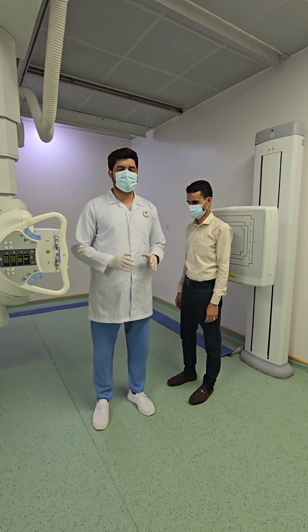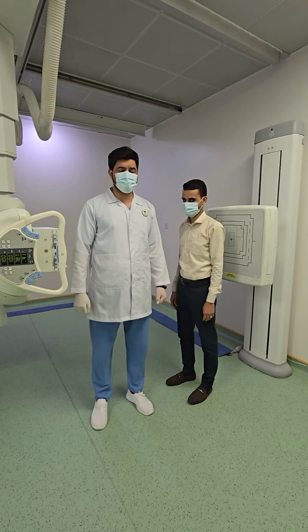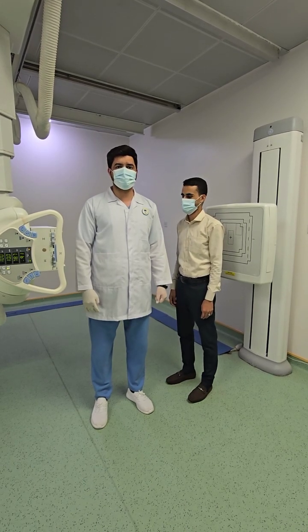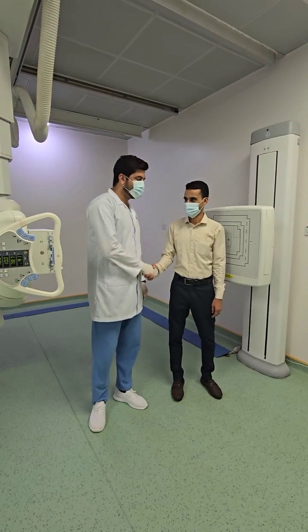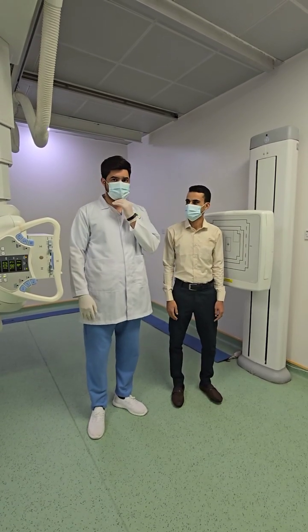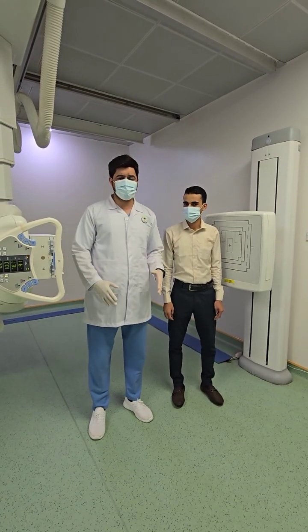In today's video demonstration, I will show you in which ways we can position a body for the X-ray. Dr. Islam is with me. Welcome, Dr. Islam. He will help me in positioning to show you how we can position a body.